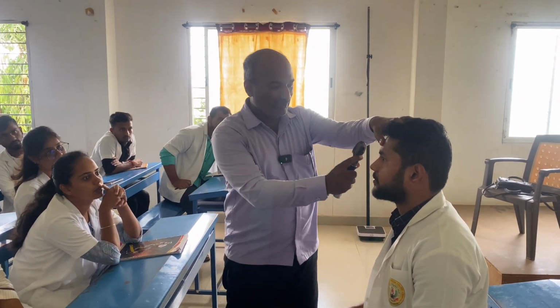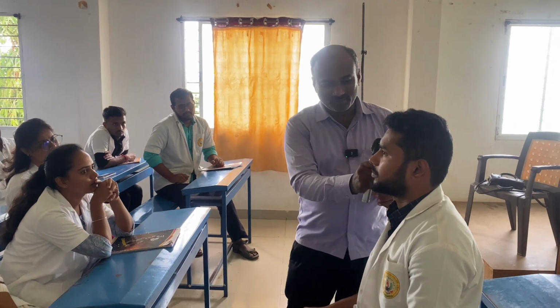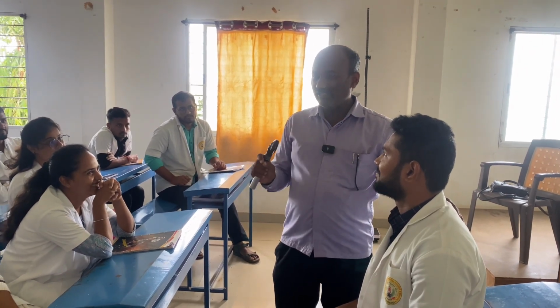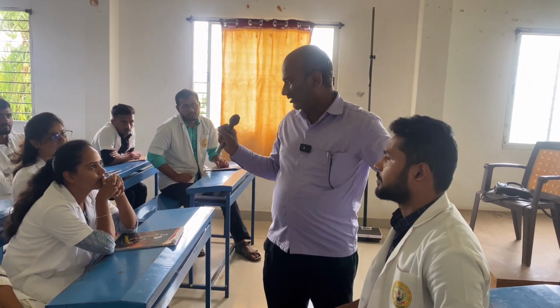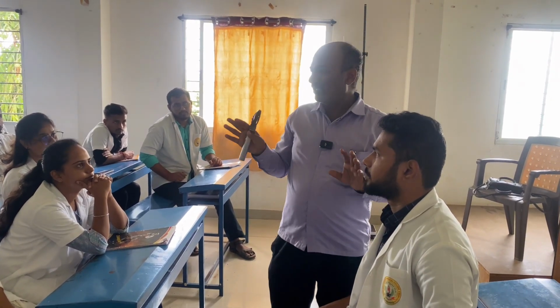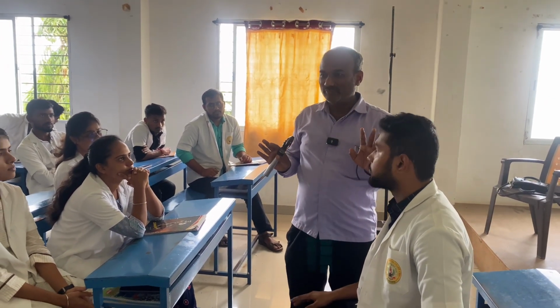If your illumination and the pupils are coinciding, then you will have pupillary reaction. You put the light over the pupil from this side, you may not have pupillary reaction. This doesn't mean he is dead, right? The pupils are nothing but a fold of muscles. They don't have any photoreceptors. Unless the light enters inside the eye, is perceived by the retina, and the signal reaches the brain, you won't get pupillary reaction, right?